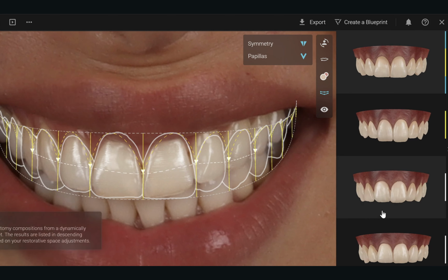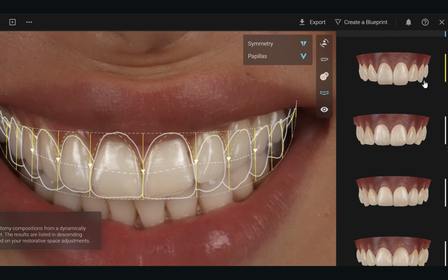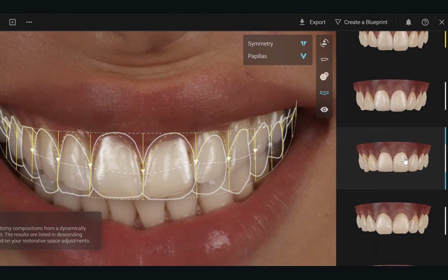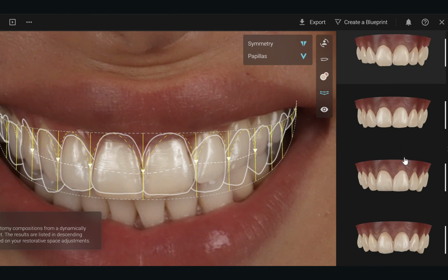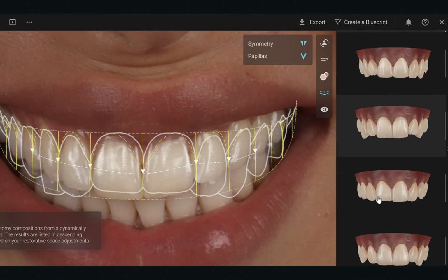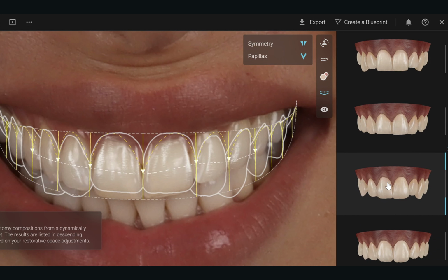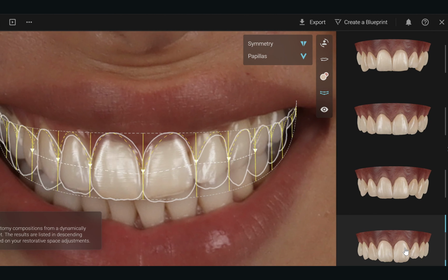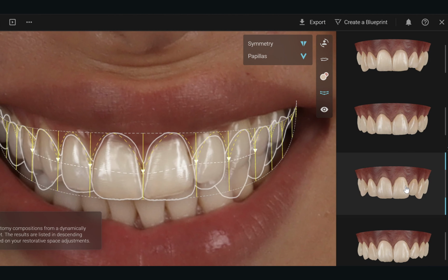If you have to really adjust teeth a lot, they're probably not the right teeth to be putting in that area, because from a soft tissue perspective, it will be much more successful if you have something that works in the current environment, or alternatively, supports the new gingival shape that you've created. And that can be really powerful in healing and maturing and developing an area.